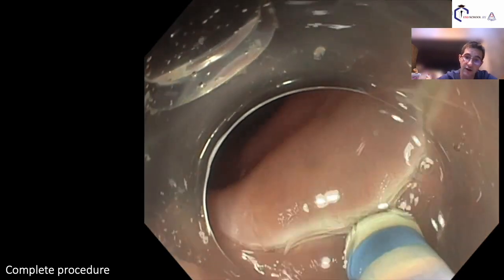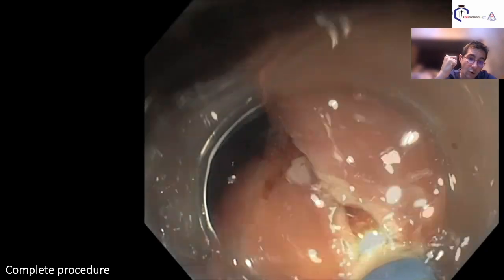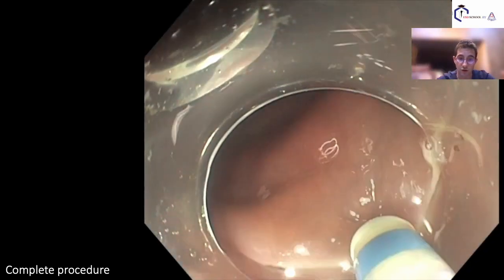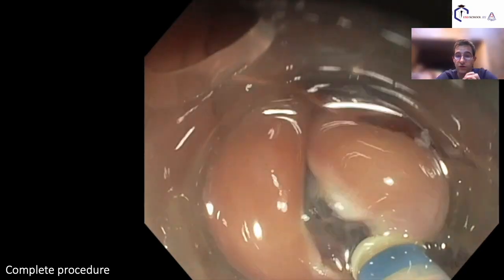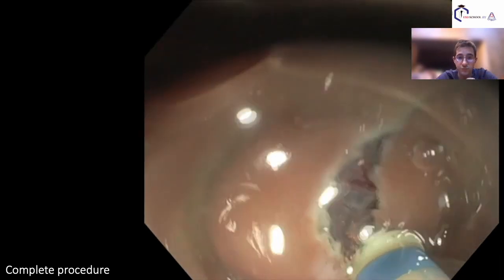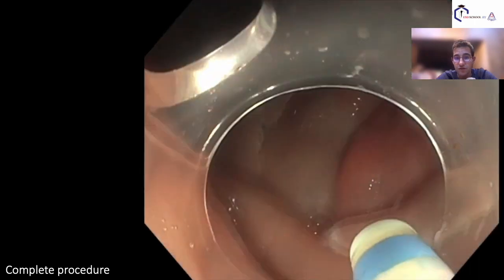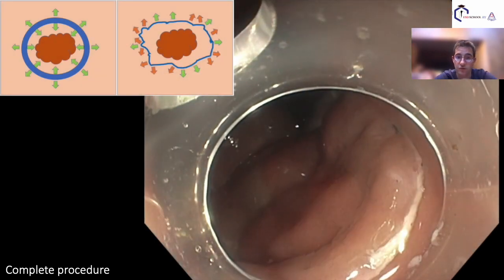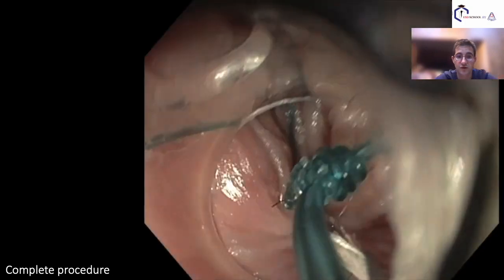Your aim is to get a round shape because if you get this round shape, all the vectors, all the force are going to the center of the lesion, and then it opens the space of your incision. You will see it in the drawing on the left soon, because our aim is to have this quite round shape of incision like the drawing on the left, and not the right one where different vectors are not good.